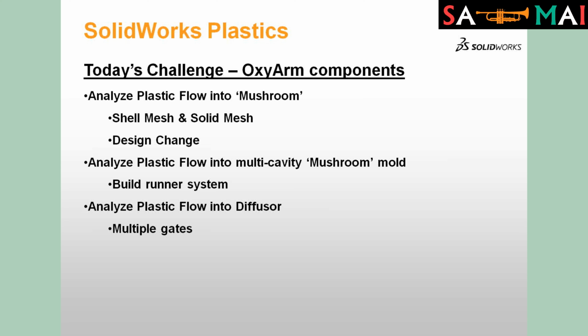The first is a mushroom, and I'm going to show you two different methods of analyzing this very small part. The first is using a shell mesh, the second is using a solid mesh, and then I'm going to show you how easy it is to do a design change and re-update your plastic mold flow analysis.